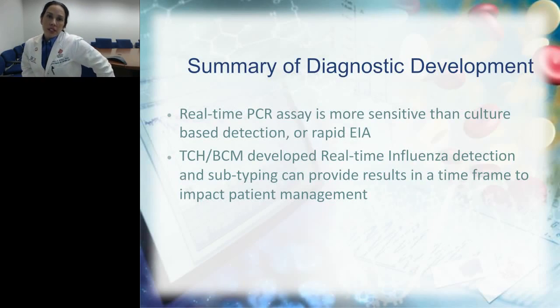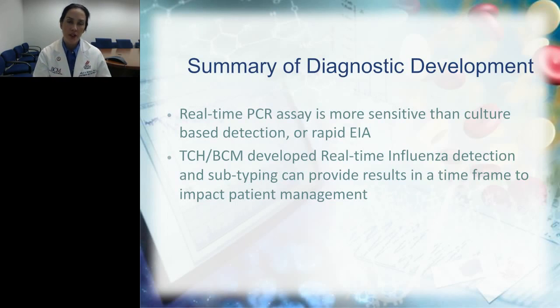We learned that the real-time assay is more sensitive than the rapid or the culture. And we also realized that we could, using our own staff and our own processes, really turn these assays around, or turn the tests around in time to impact patient care.